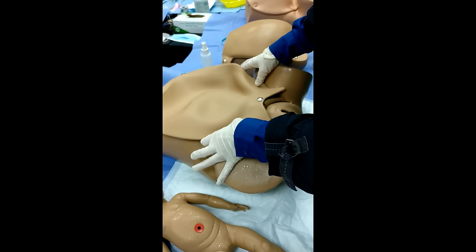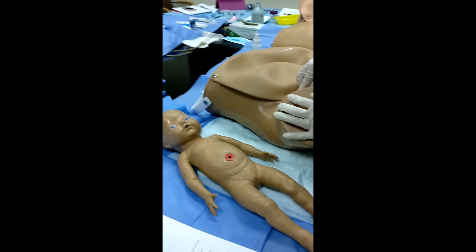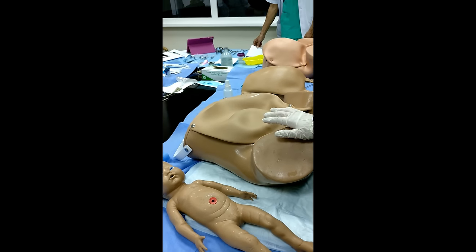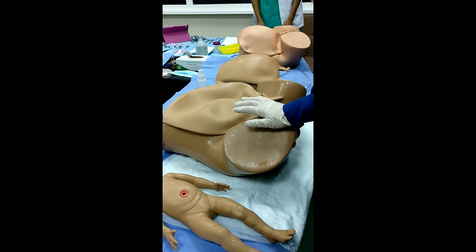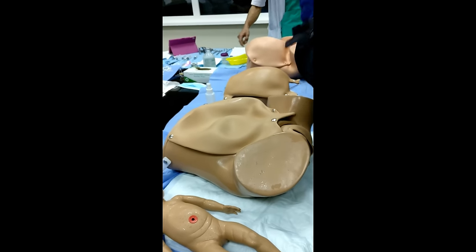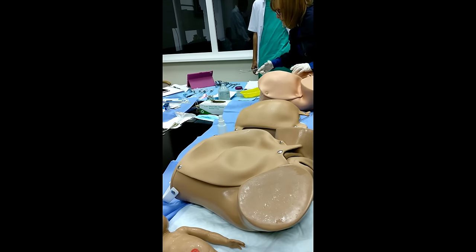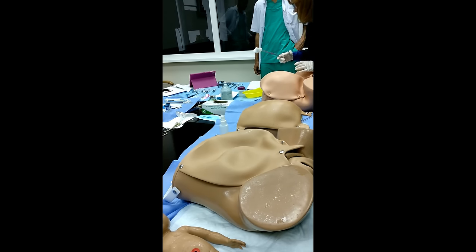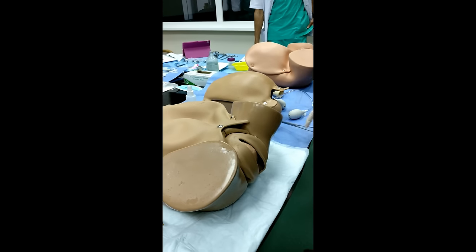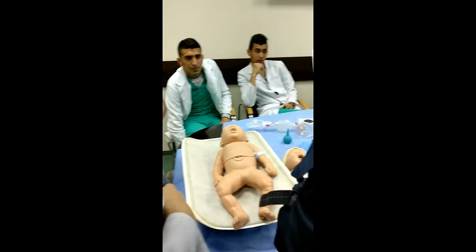Show the maneuvers to help the delivery. You introduce yourself, first hand hygiene, after that disinfect the perineal region. You have instruments, and an alcohol pad or antiseptic solution. You disinfect the vulva and the perineum. We should use sterile fields.